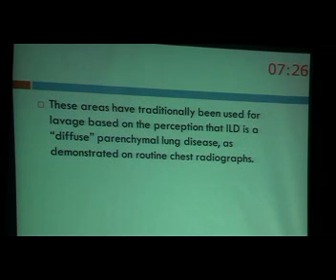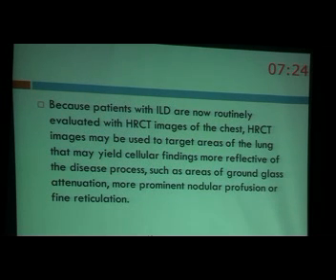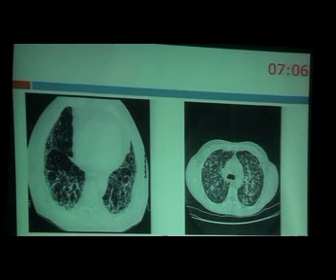ده لو احنا بنقول كده احنا بنشوف بلين اكس راي. ان بعض الحالات دلوقتي احنا في عندنا الهاي ريزوليوشن سيتي سكان وده كورنر ستون في الايفالويشن اوف اني انترستيشن لانج ديزيز. وبالتالي بعض الانفستيجيتورز دلوقتي بيريكومند ان بيفور دوينج البرونكوالفال لافاج تو هاف ا لوك ات ذا هاي ريزوليوشن سيتي سكان. We look for areas of nodulation, area of ground glass, the area اللي suspected فيها active disease. ويعمل منها اللافاج rather than the areas with fibrosis and with trabeculations and with end stage disease. Mostly this will be fibrotic areas.